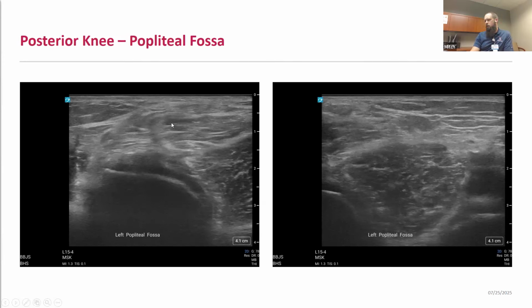The next slide, I've got a video looking at probe positioning. You want to be careful in evaluating these areas because depending on how you're holding your probe, either the medial gastroc or the semimembranosus can look anisotropic and lead to potentially false diagnosis of a Baker's cyst when it's just an anisotropic artifact. And then if you scan more towards the popliteal fossa, medial femoral condyle, lateral femoral condyle, you'll get your more vascular structures, which tend to be more lateral, and you can identify these with color Doppler.